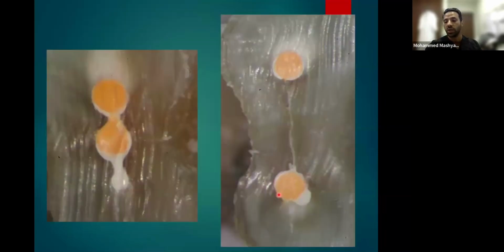So I would advise you, whenever you have extracted teeth in your clinic, do root canal treatment to the best you think you did. Then start cutting the root and look at your job, how good you are doing. So you can evaluate yourself.